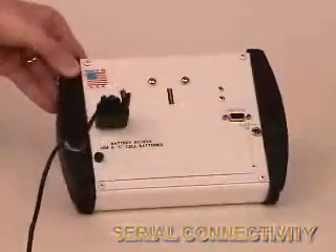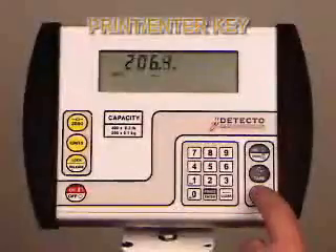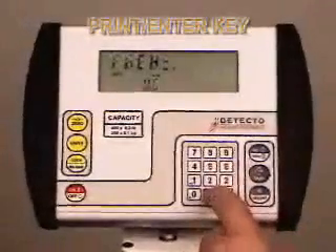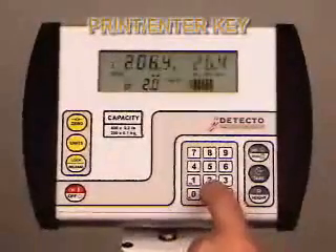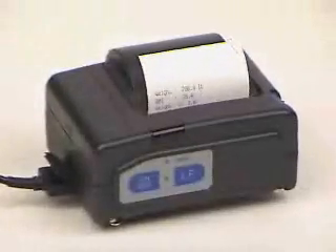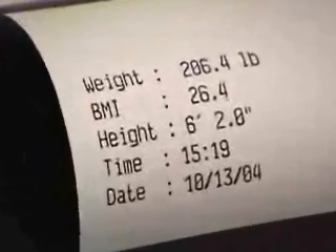Data sent to a PC is very useful in electronic medical record keeping. Printing weight data is easy with the new 758C. Once a printer is connected to the 758C's serial port, it's just a matter of pressing the print enter key. In this case, a 6'2" patient weighing 206.4 pounds is having their BMI calculated. With a simple push of the print enter key, the data is output to a printer giving you a paper copy of weight, BMI, height, time, and date.